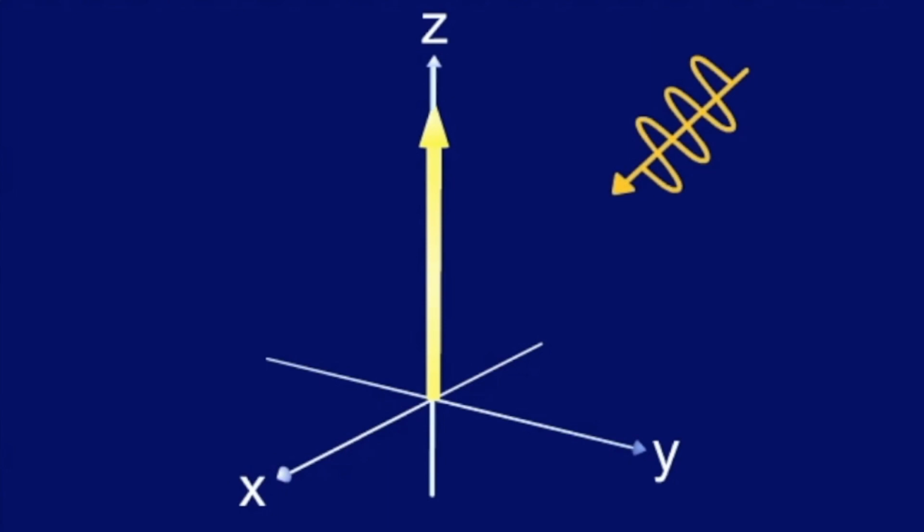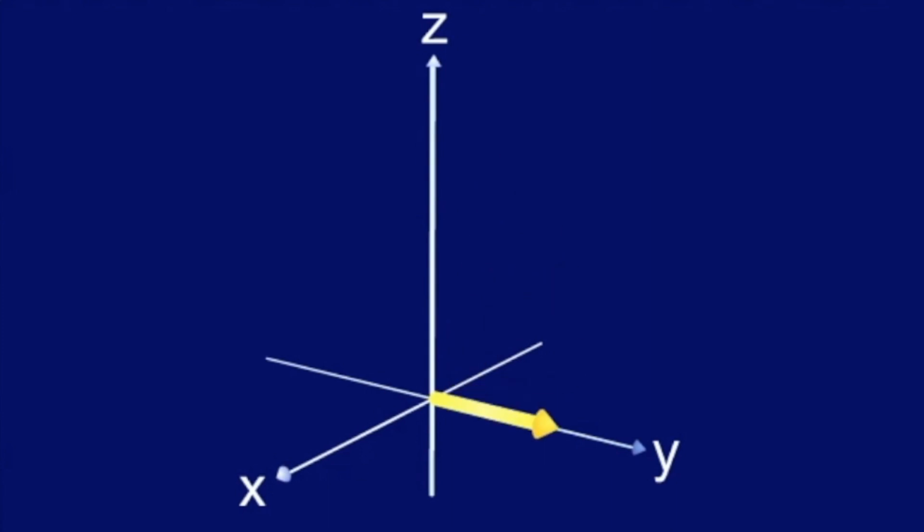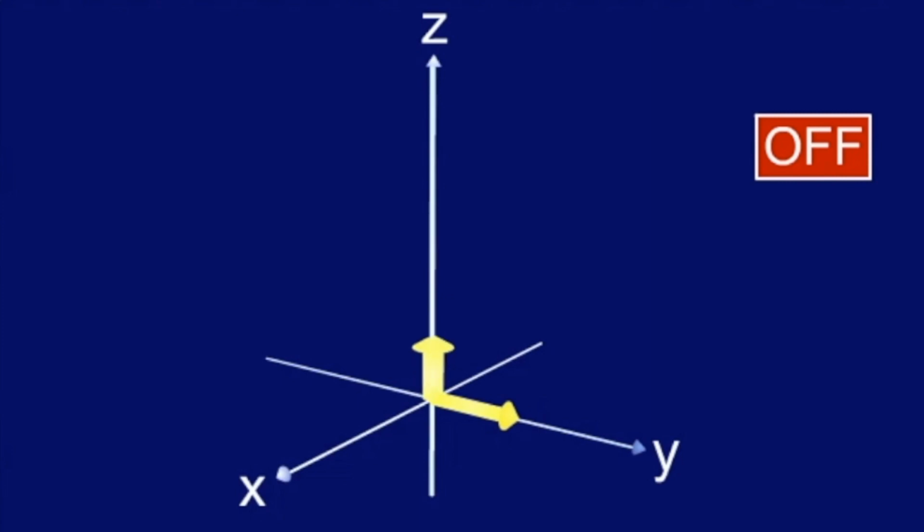When the RF pulse is sent in, the longitudinal magnetic vector is tilted 90 degrees to the side. As we already know, this vector moves corresponding to the precessing protons, but for the sake of simplicity, we'll leave out the motion. After the RF pulse is switched off, the transversal vector decreases, while the longitudinal vector increases.